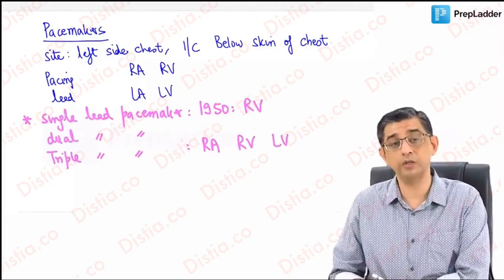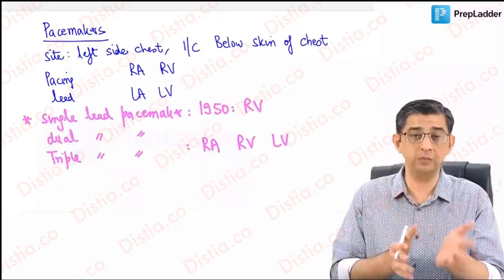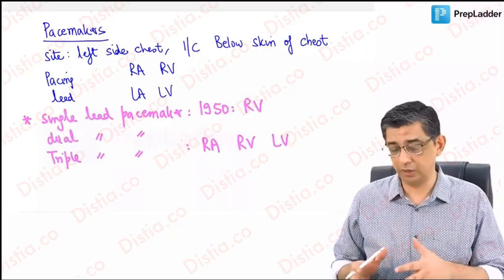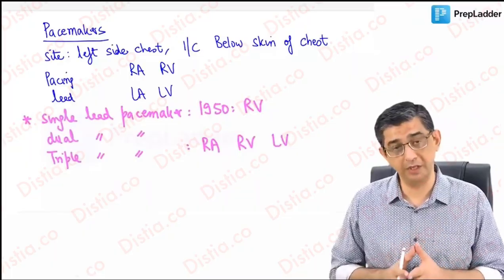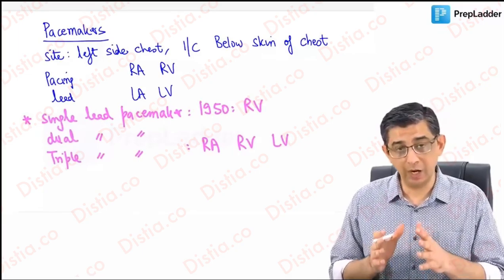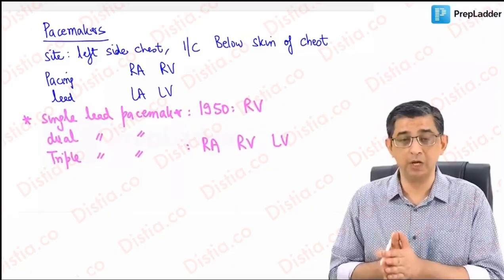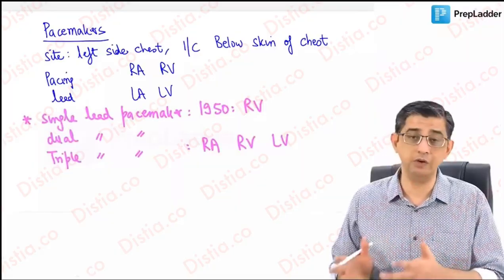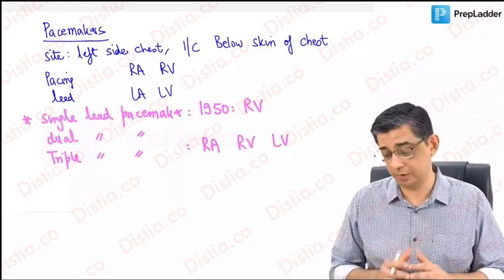On this, the query of most doctors is, well, why are you not trying to control the left atria? One, I wanna say that if oxygenated blood comes in, the left atria will automatically be able to do its job. And second, the more control I try to achieve, I will obviously consume more battery. It will require a more sophisticated circuit as well. In a nutshell, the technology has been apt to ensure a proper firing of all these chambers at the right time. We are able to ensure proper blood goes to lungs for oxygenation, and once we time the left ventricular contraction or ejection, systemic circuit and cardiac output will definitely be obtained.